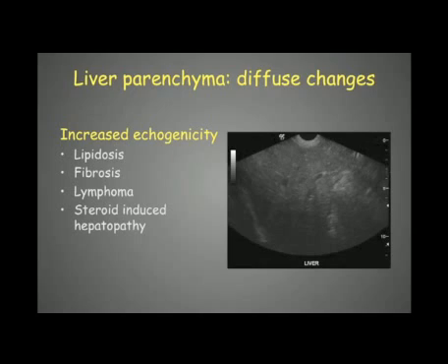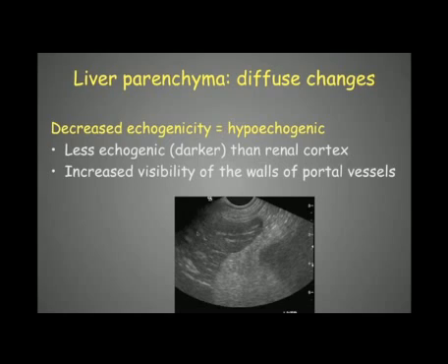Lipidosis, lymphoma, and steroid-induced hepatopathy are typically associated with increased liver size as well. In contrast, chronic hepatitis is expected to show a decreased liver size. We can also see diffuse decreased ecogenicity of the liver parenchyma — the liver appears darker than the renal cortex.